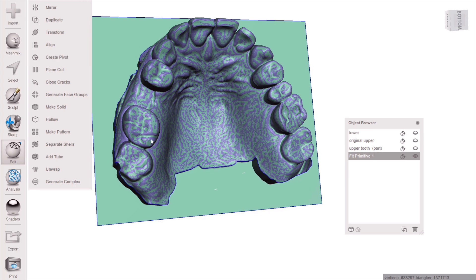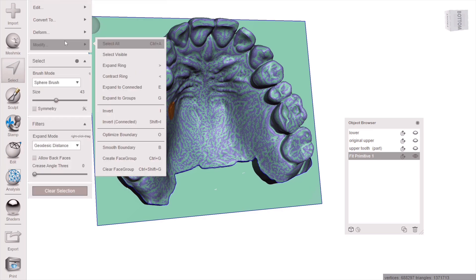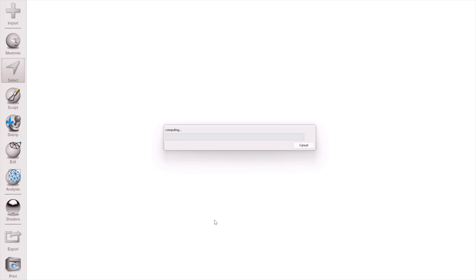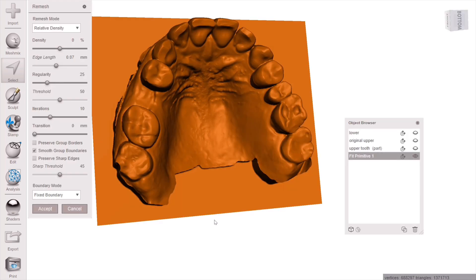Now we need to remesh this model, so highlight both of those and hit Combine, then go to Edit > Remesh. It's going to take a good while to regenerate that mesh into a new combined mesh — this can be quite graphics-card intensive, so this is also when you could get crashes. But we're creating a new model that is technically a single model. Once done, accept the remesh — this is the model on which we're going to make our partial denture frame.